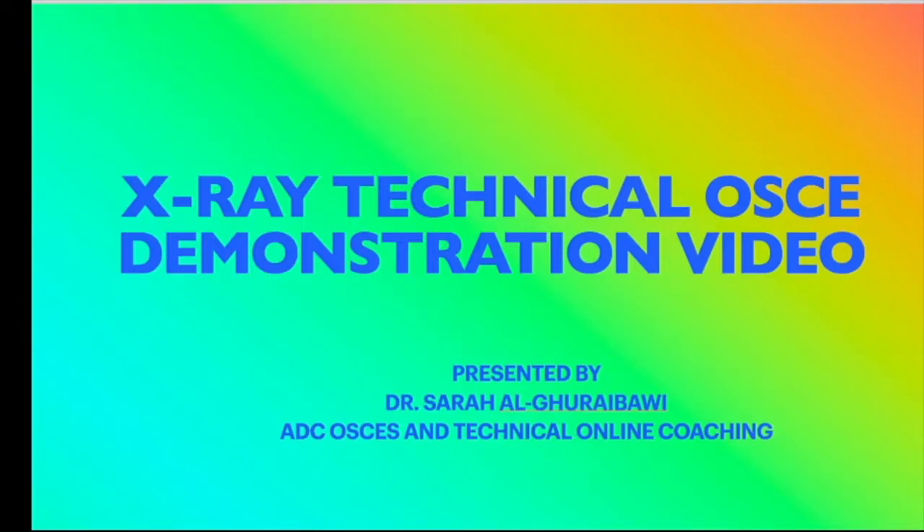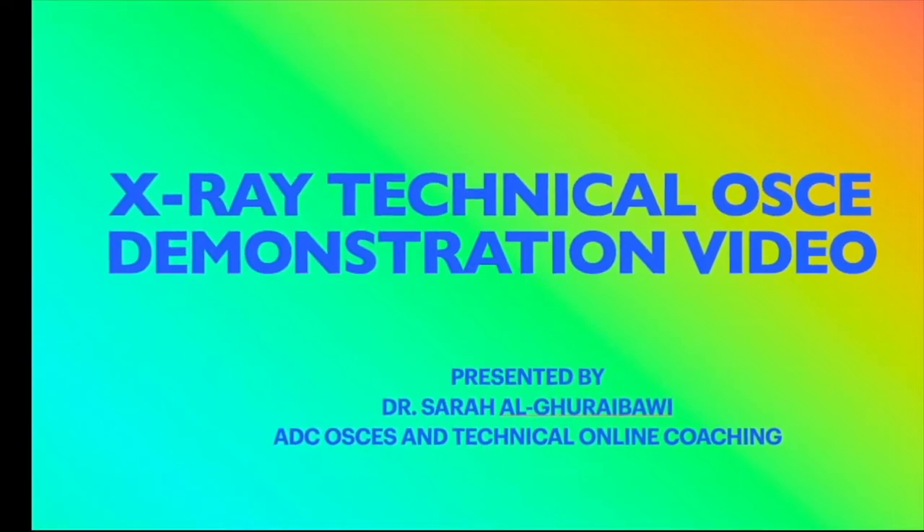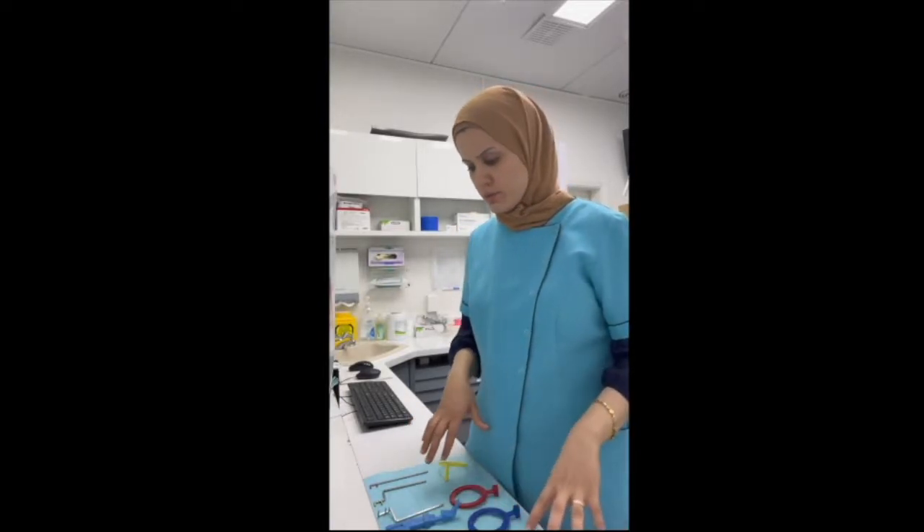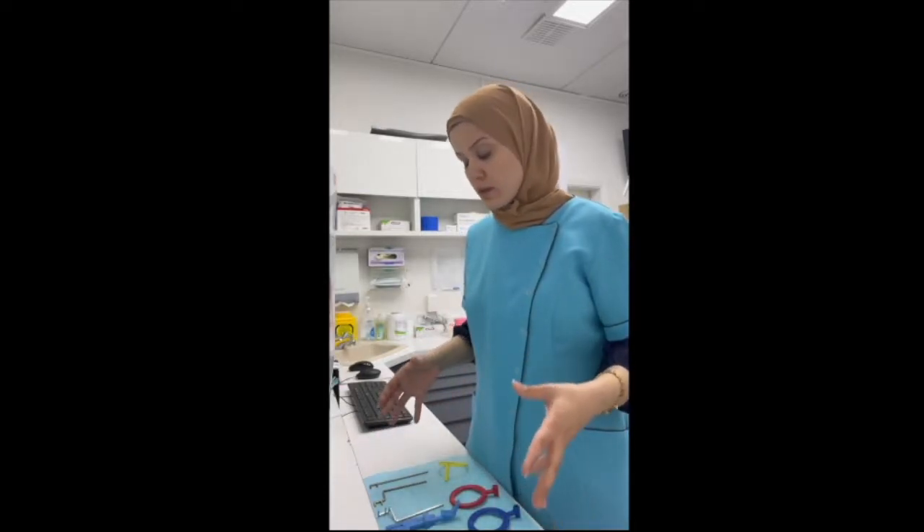In this video I will be showing you how to tackle the X-ray OSCE from the ADC practical exam. I will be showing you what you will find in the common area or the clean area, and we'll take you then to the mannequin so we can set up, expose it, and show you the technique.